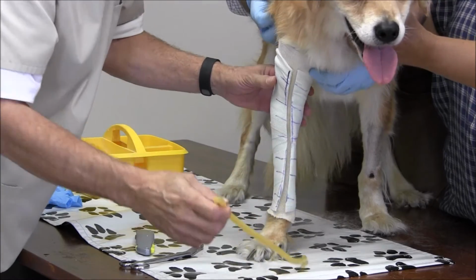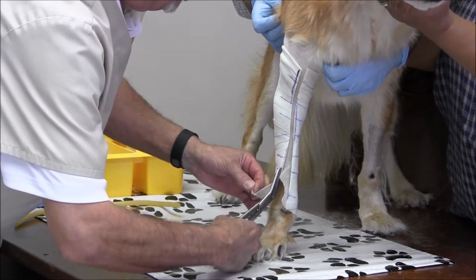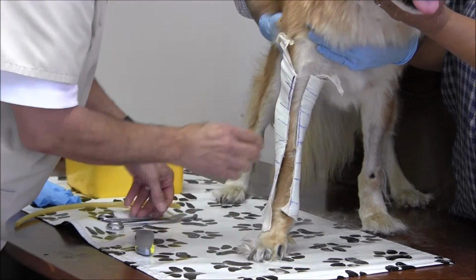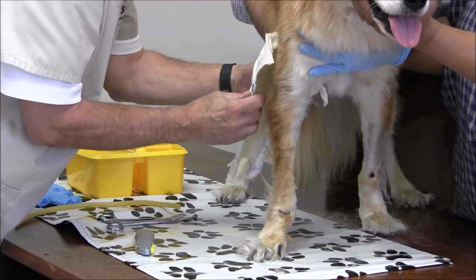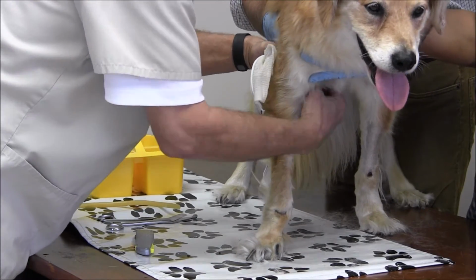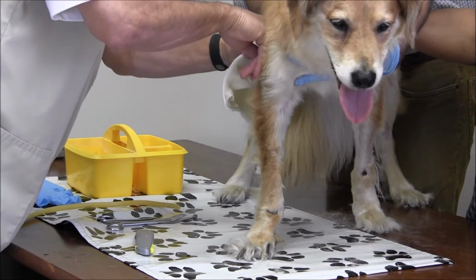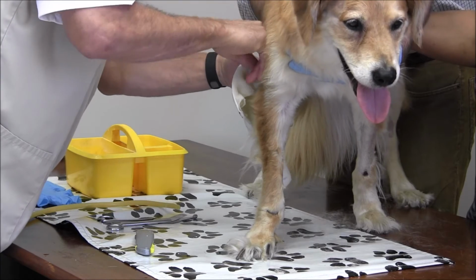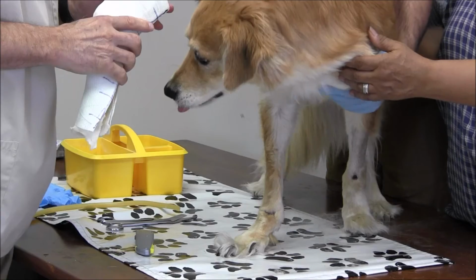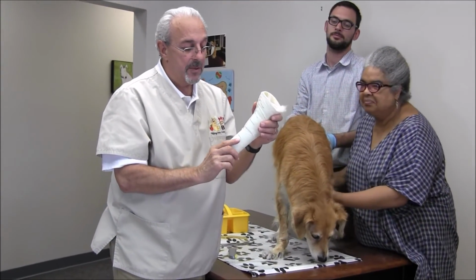Now we can go ahead and pull the tube out, and then we take a stockinette, bandage scissors, and we can cut off the stockinette. From there we can go ahead and gently pull off the stockinette, and if we have a little bit of hair, just make sure that we get the hair out of the cast.